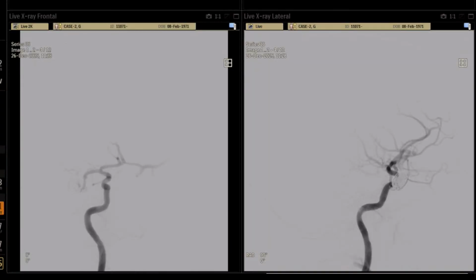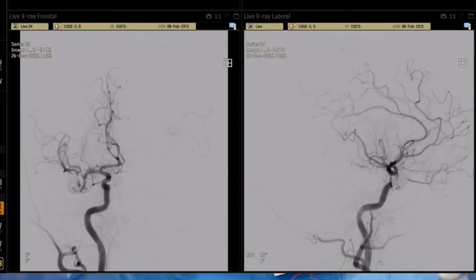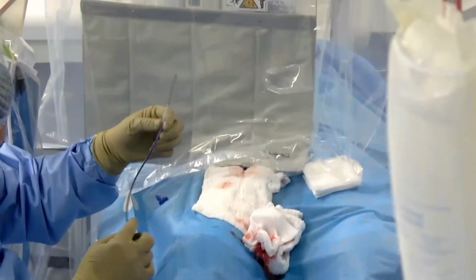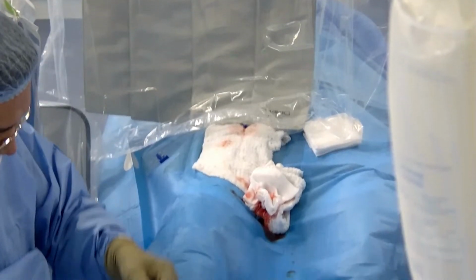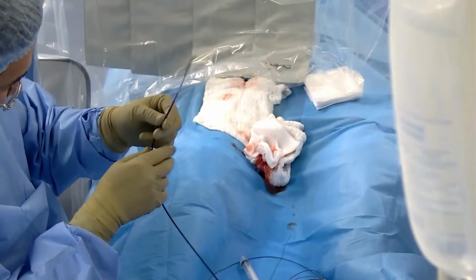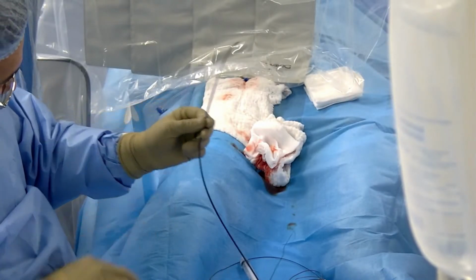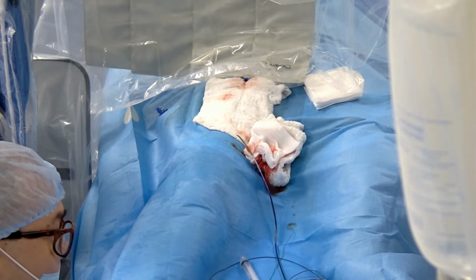Let's see the control. Okay, this is a Pilot guiding catheter. It looks like it took the angulation of the aortic arch, and the tip is hydrophilic. It's 100 centimeter, small angulation. It's like this. Okay. Let's see the expertise.